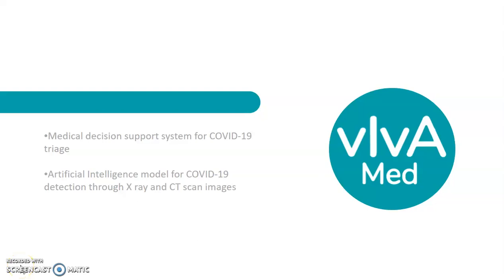The vIvA-Med system is a medical decision support system for screening/triage of COVID-19. It uses an artificial intelligence model to detect COVID-type lung diseases from the analysis of X-ray images and computed axial tomography scans.